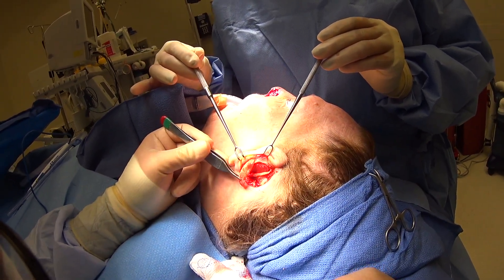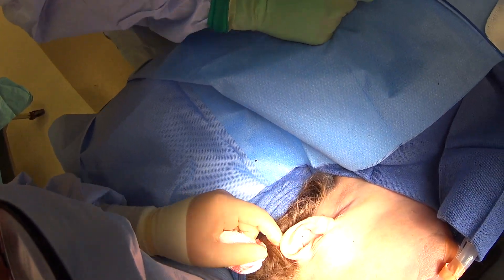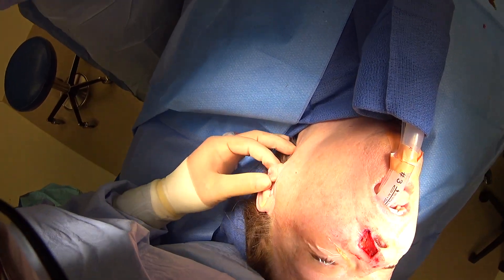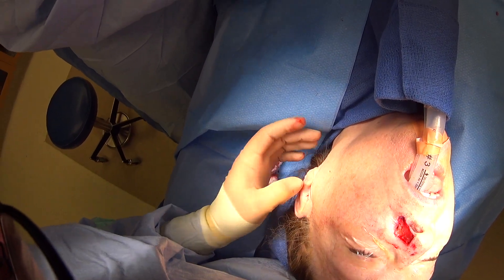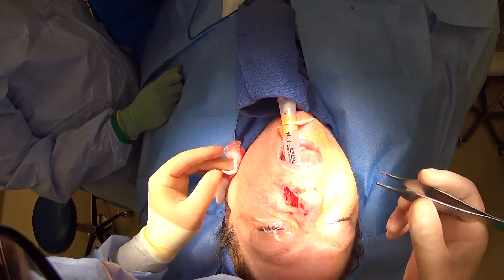Now we've taken our cartilage. You can see we've closed the ear — that incision is going to be hard to see from a frontal view. It looks good, the ear has a normal shape. We've put some through-and-through sutures in the ear to eliminate the dead space where we took the cartilage, but she'll do well with that.